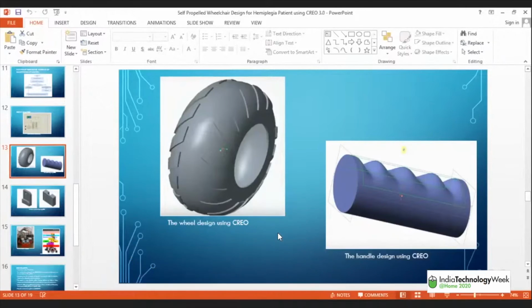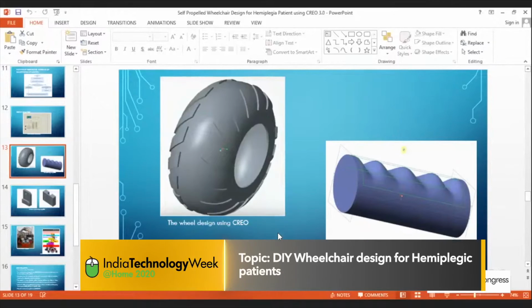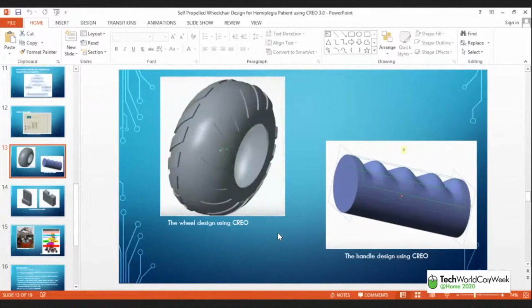The material should be flexible and not cause much friction to the body, because when a patient is on the wheelchair, the person is seated there for a long duration of time, right? So with those concerns, we started taking those components which are mandatory to be designed and can be replaced in an existing wheelchair. We, however, did not replace all the components. The first part is the wheel. The calculation of the radius of this wheel is already shown in the beginning, last few slides back.